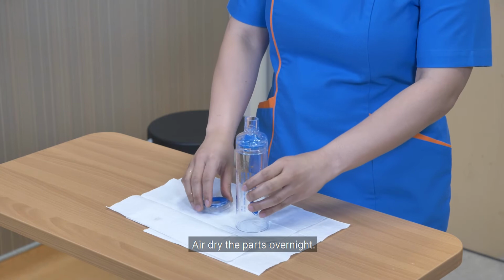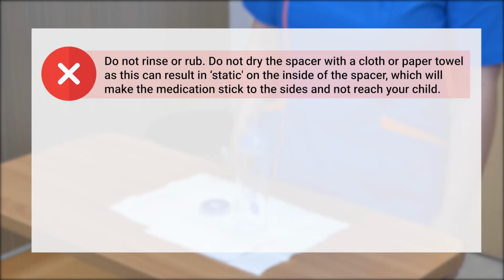Air dry the parts overnight. Do not dry the spacer with a cloth or paper towel, as this can result in static on the inside of the spacer, which will make the medication stick to the sides and not reach your child.